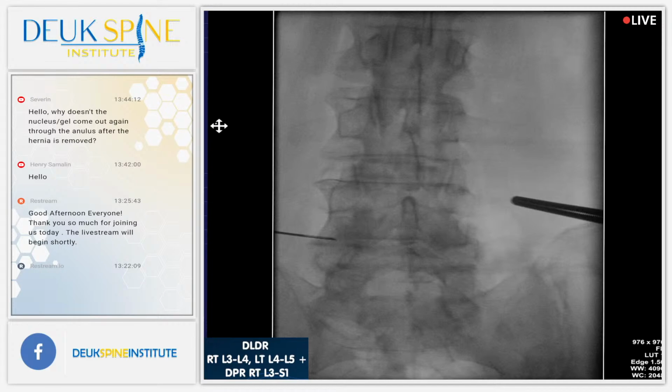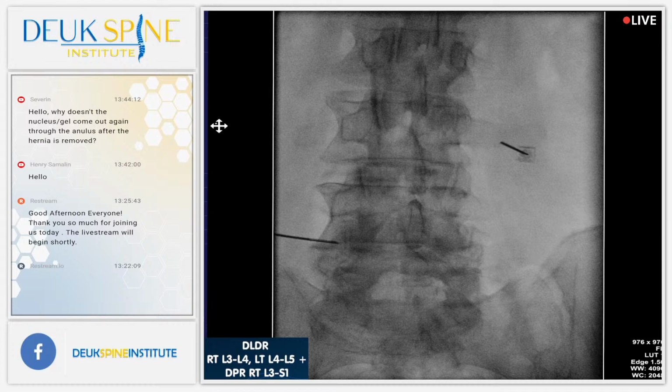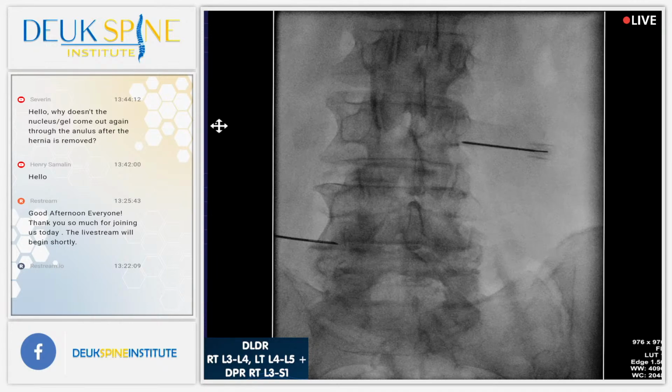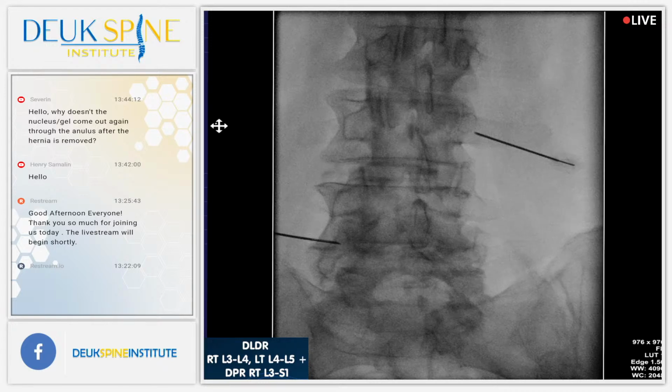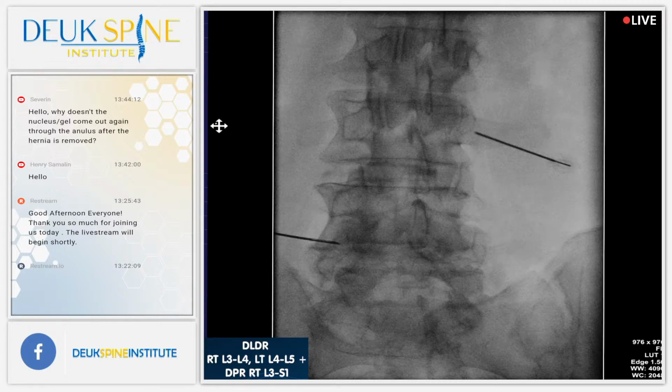Shot. All right. Not too bad. We're heading in the right direction. Need to be a little bit higher. Shot. That looks good. That feels good at least. I feel the transverse process. That looks good. Shot. That is not quite the perfect spot, but we're going to get there. Go ahead.